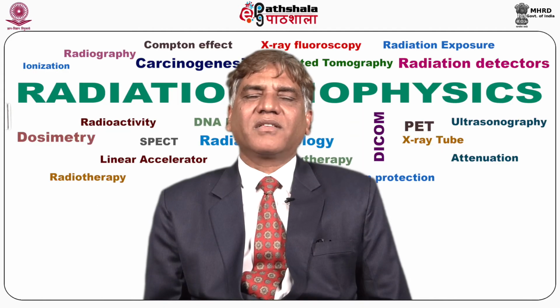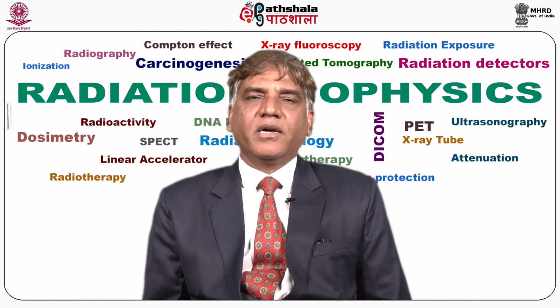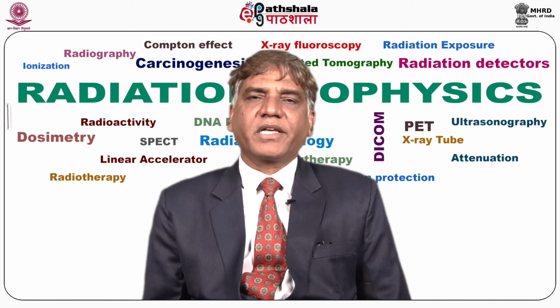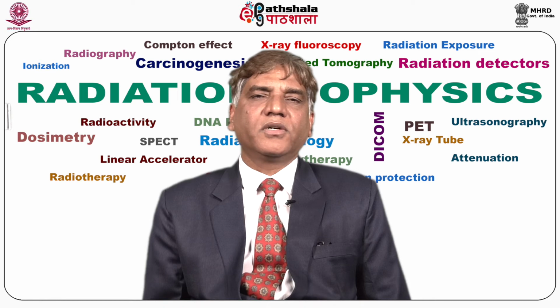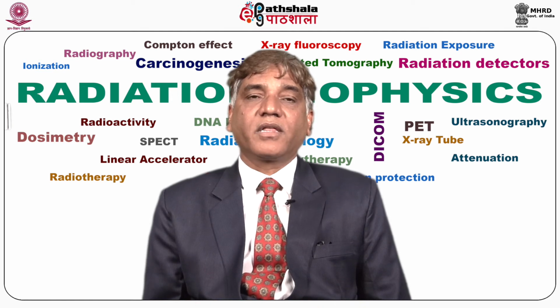So this is usually reduced by using another method called filtered back projection. As I told you, this is a very common method. It is used in almost all scanners today. It is similar to back projection, except that the image is filtered to counterbalance the effect of sudden density changes, which causes blurring as in the case of simple back projection.